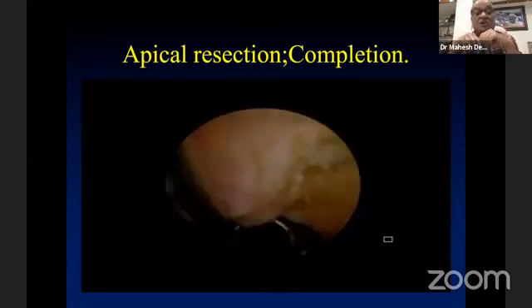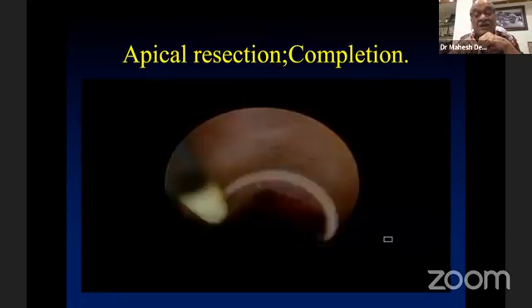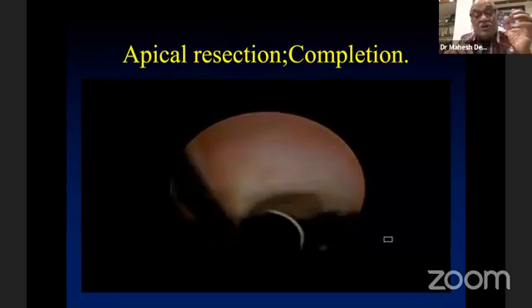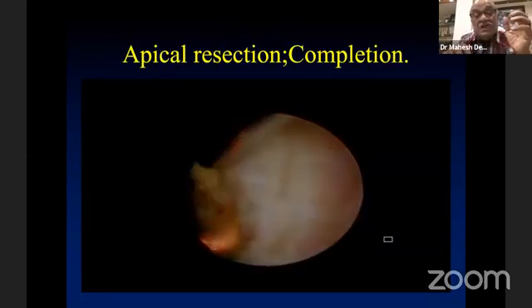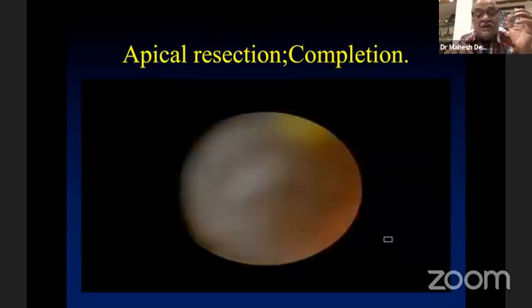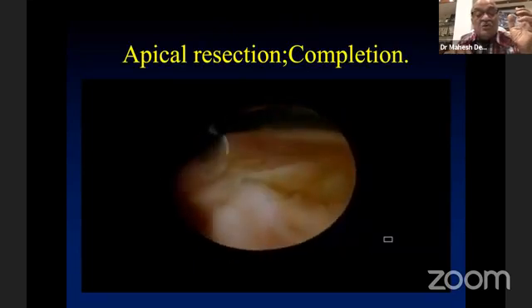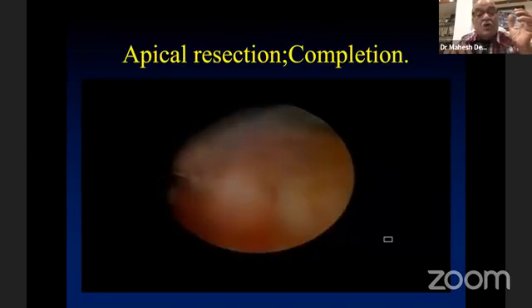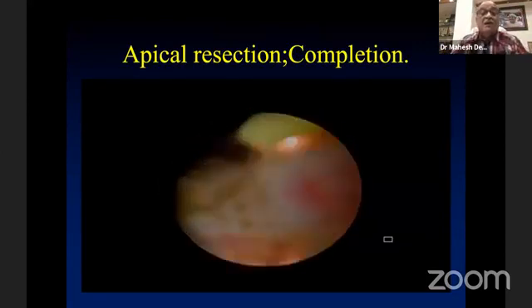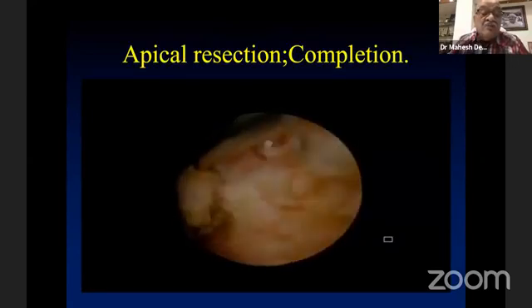So always make sure that I'll go back and see, and then when you are moving around, you will be able to see the prostate which is bulging. You can take it out, and then you have counted the length of that lobe, and you know that about 15-20 cuts you will be near the capsule. Now you don't want to go near the capsule, because you are likely to perforate the venous sinus, and you can have torrential bleeding and infection.